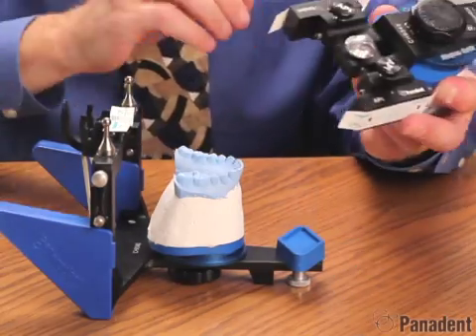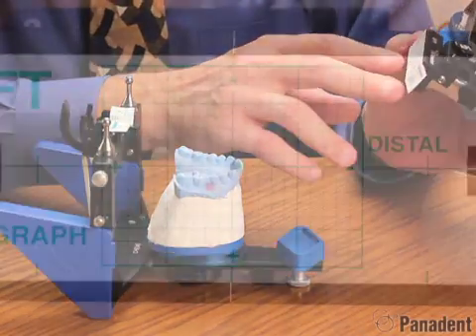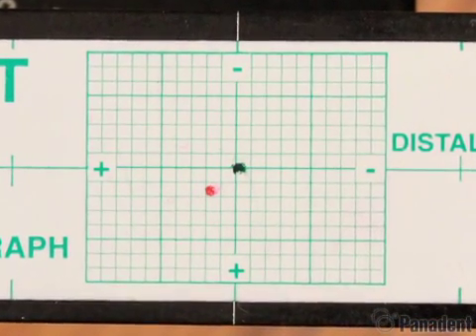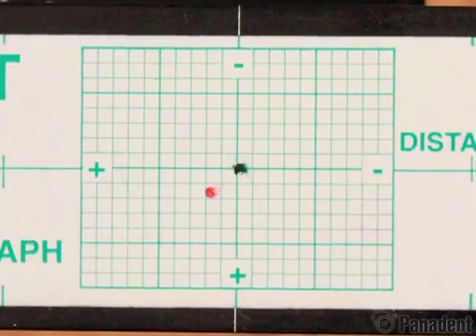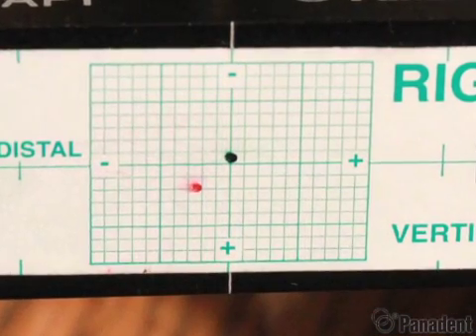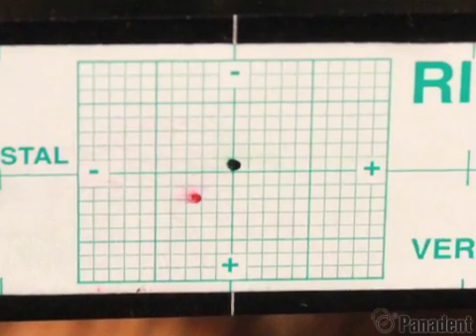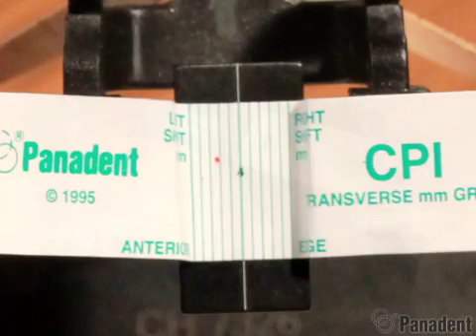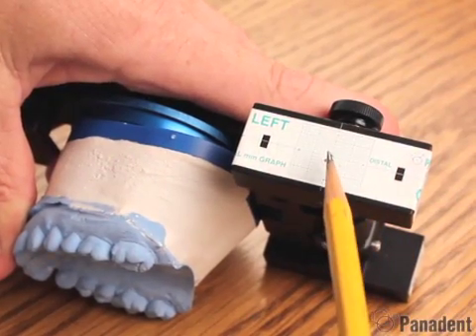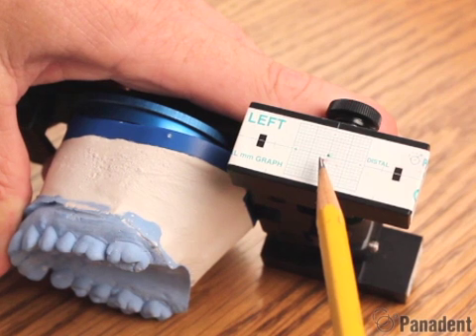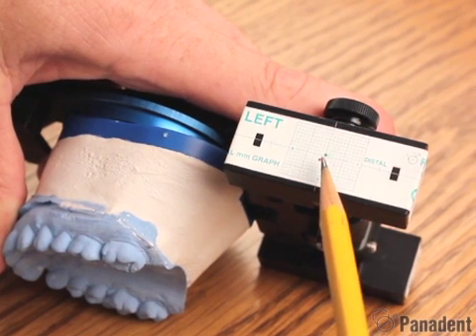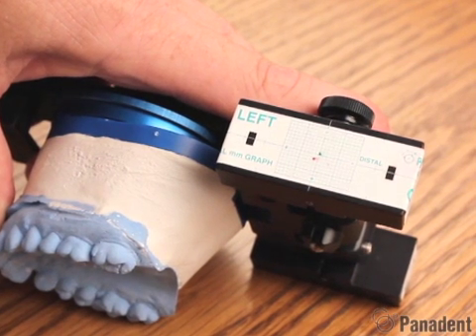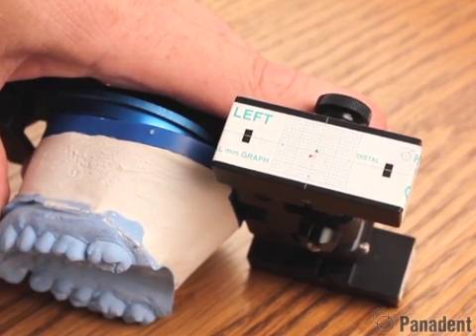Now we go ahead and mark the graphs. I can see on the patient's left side that the condyles come downward and forward, which means it's possibly a slide. On the patient's right side the condyles actually move downward and backward, which is actually a fulcrum. Then we can see the horizontal graph. If we review the graph again we can see the CR green spot and the MIP red spot — so when this patient bites their teeth together the condyle comes downward and forward.